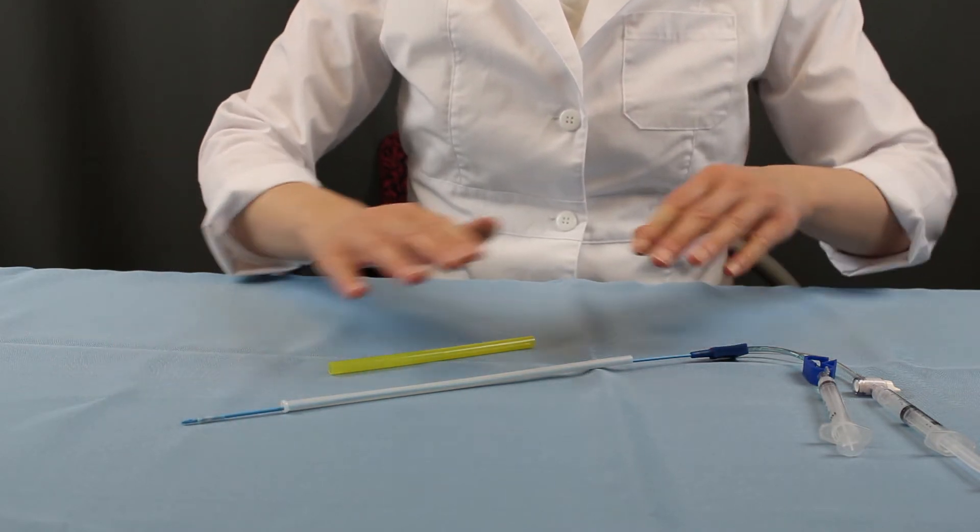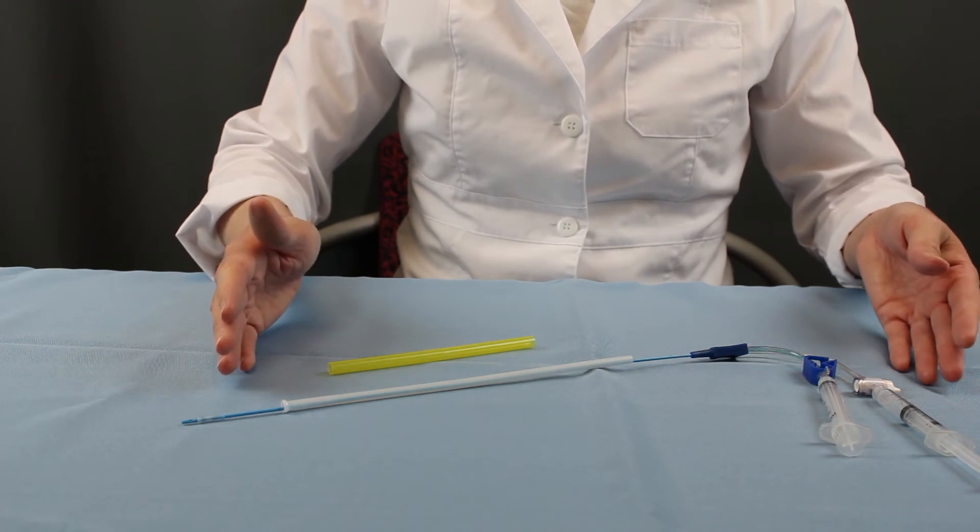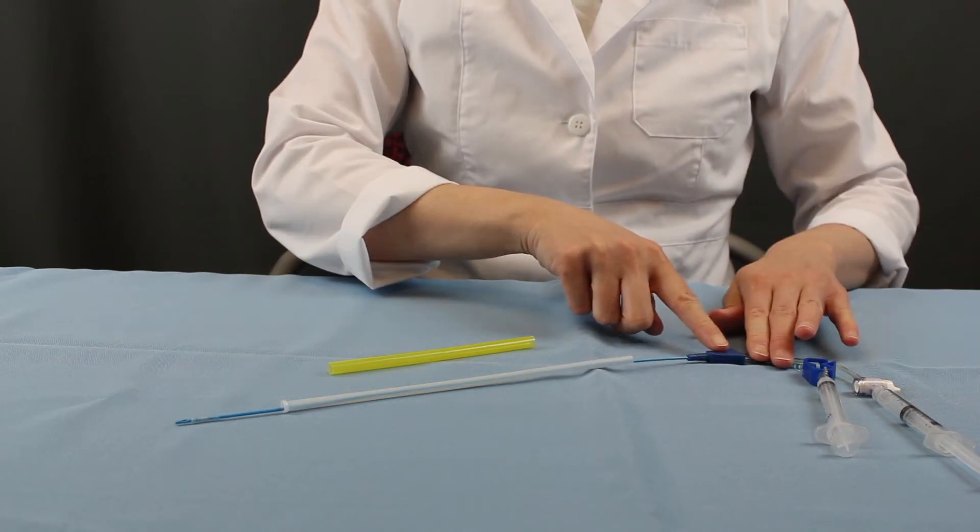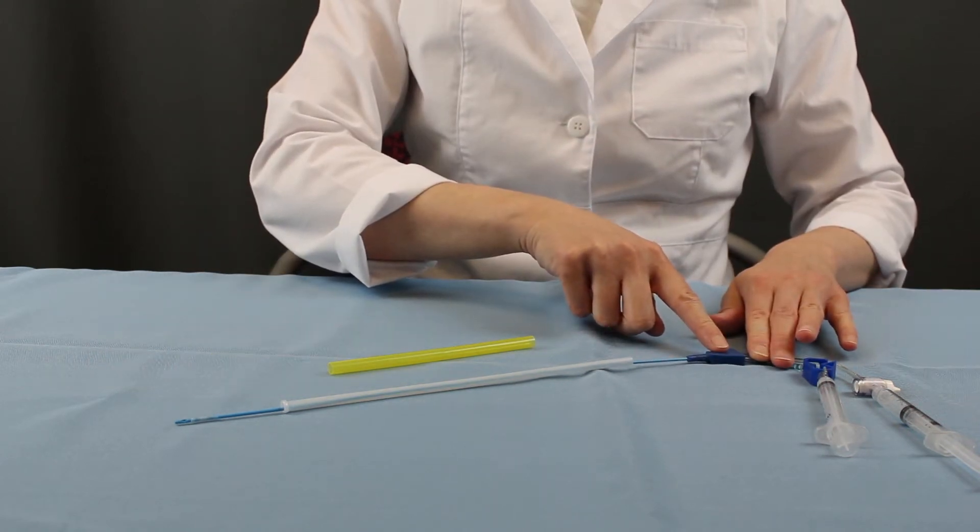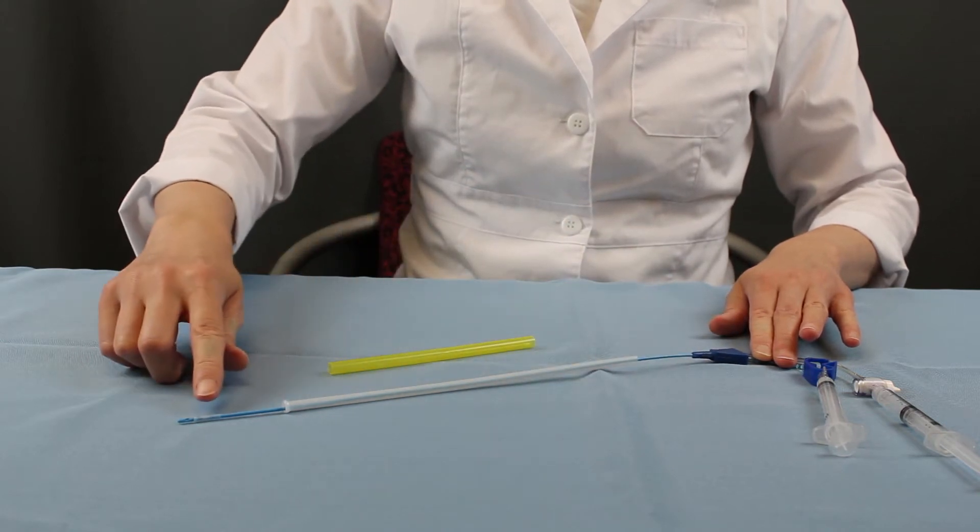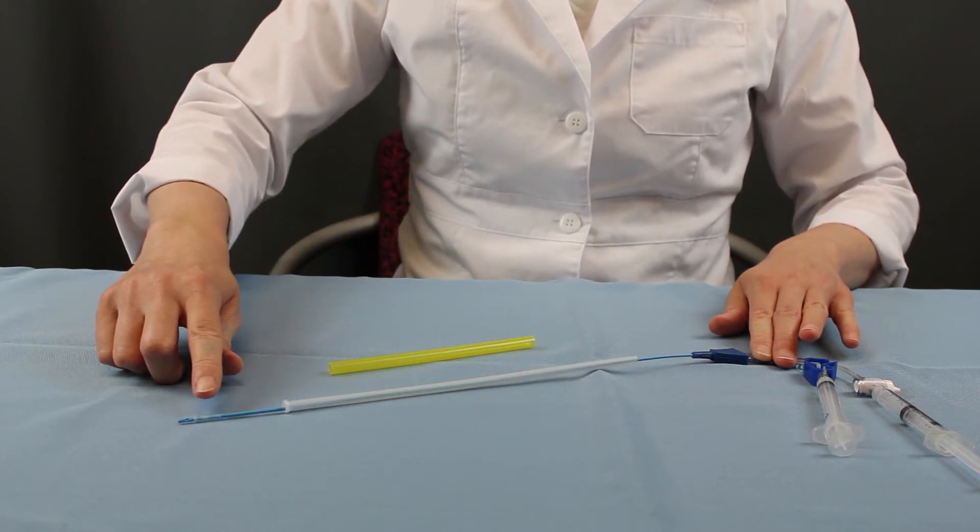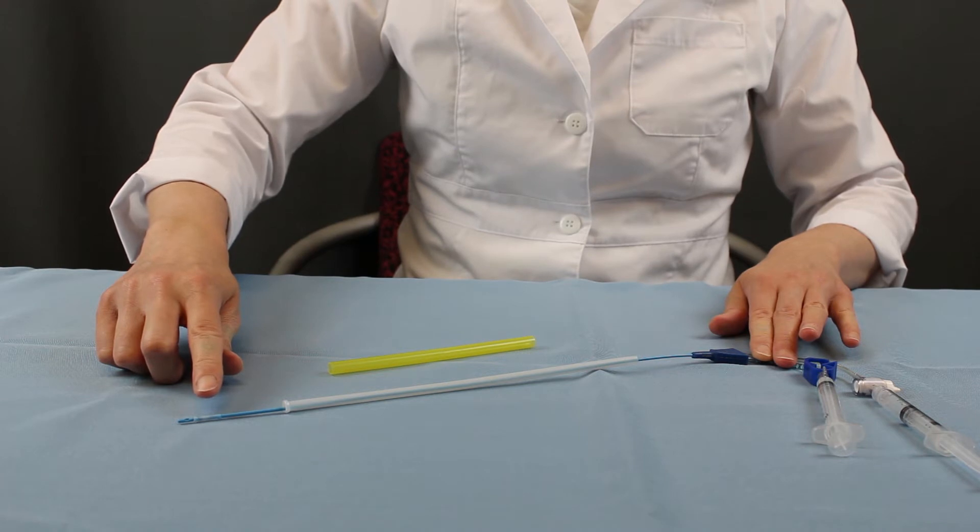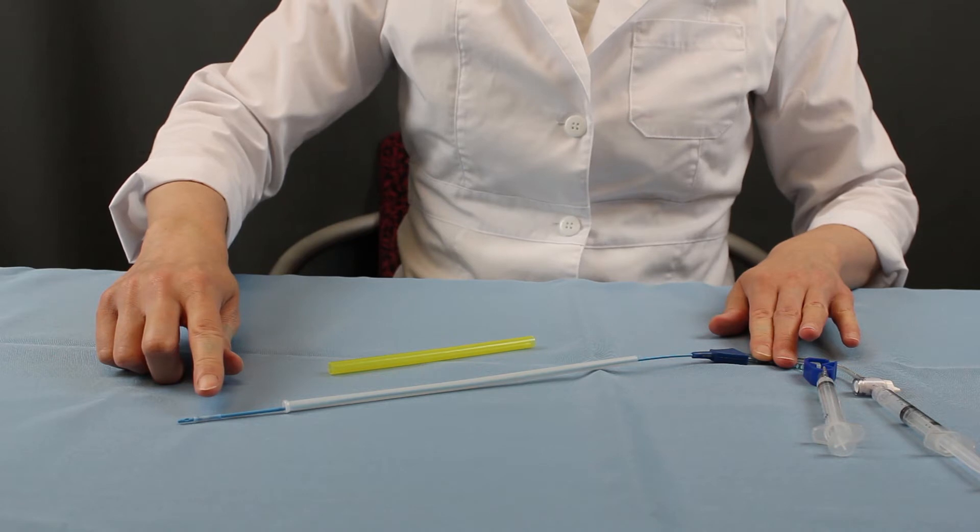To ensure integrity, 100% of HSG catheters are quality checked. The junction is tested to ensure a leak-free connection and every balloon is tested for inflation and concentricity, ensuring a proper seal with the internal cervical os and eliminating the need to prime the balloon.